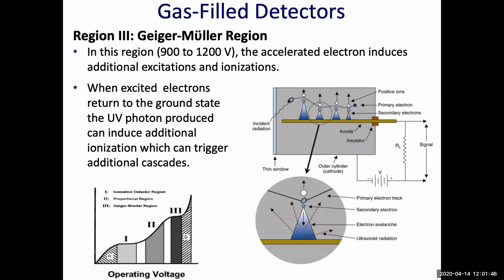After some time, around the anode, they collect very slow, heavy positive charge. This reduces the electrical current between the cathode and anode, and in this way the continuous ionization cascade is terminated.